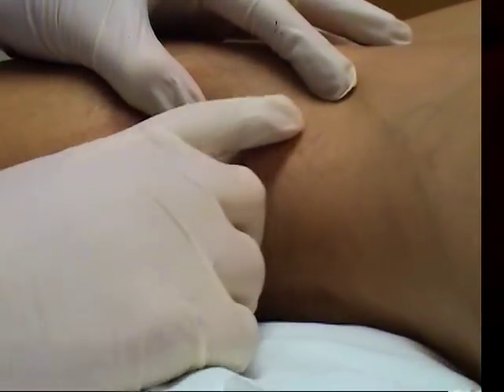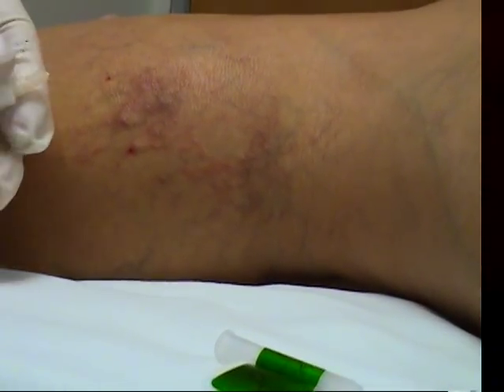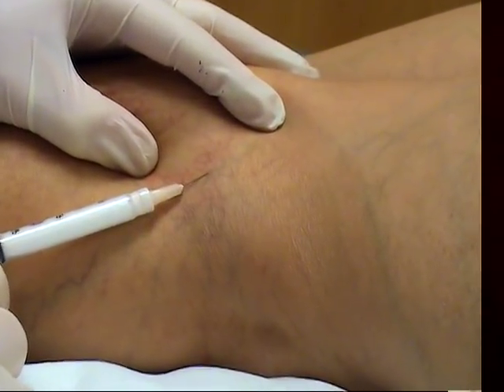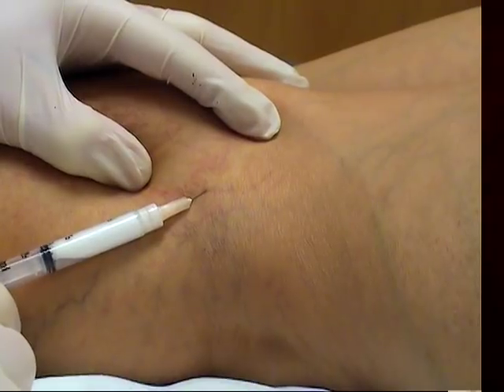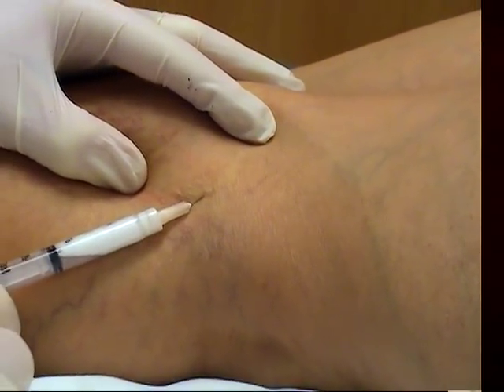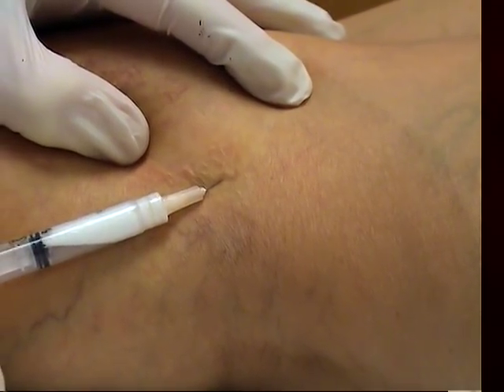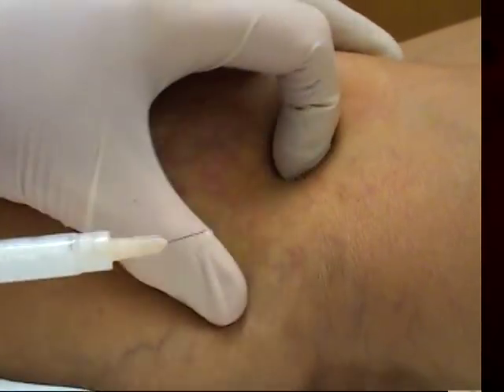We're going to do this area here. You see this is a larger reticular vein underneath here, with some lighter pink vessels associated. Many people say that you've got to get the reticular vein first — I don't know how valid that is, but that's what people say, so let's just do it. That's pretty much about as good as it gets in terms of being in the vessel. Don't press too hard on the syringe or you'll extravasate. But you see all those tiny vessels now look white — it looks like a topographical map.